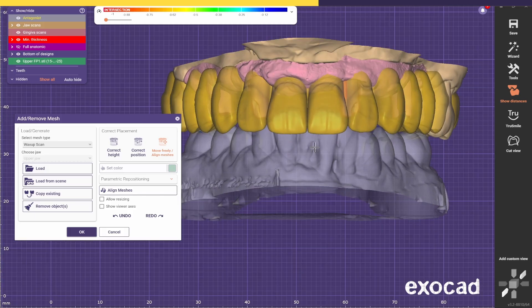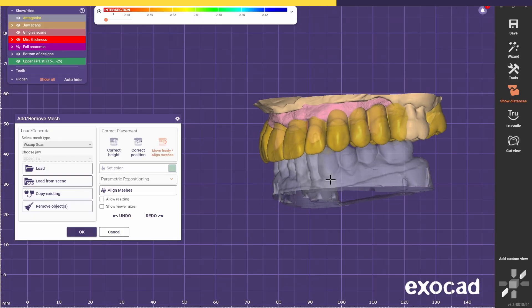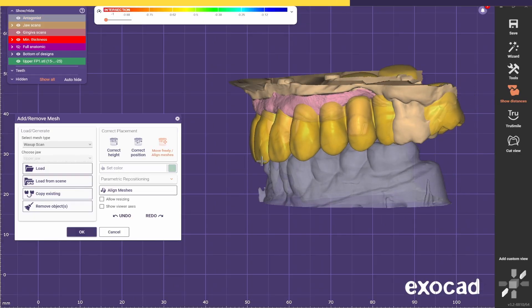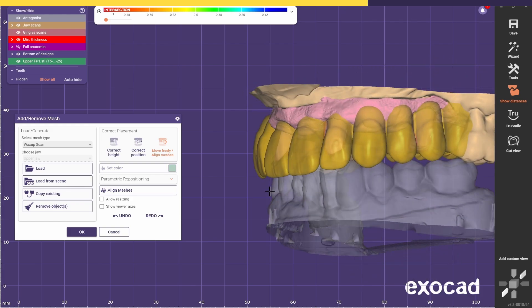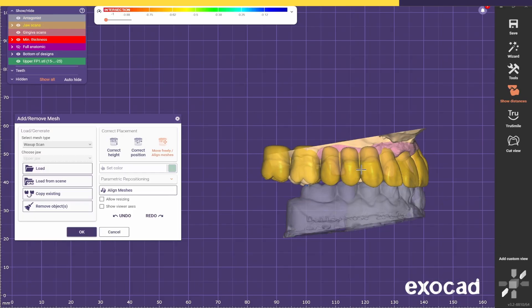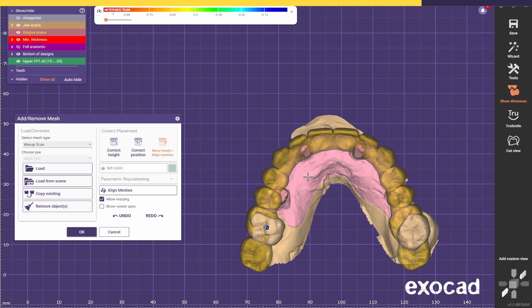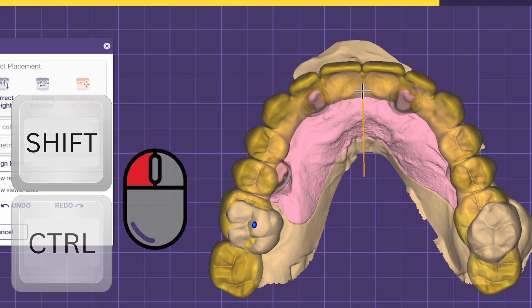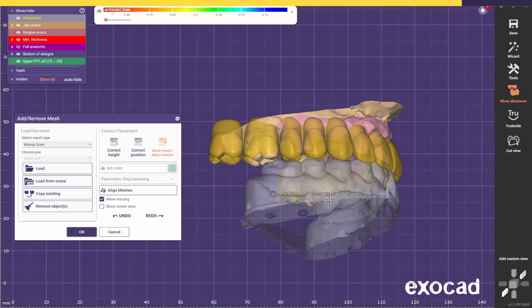Because in this case we don't have any pictures and we don't have any pre-op, I'll just try to place it in the most optimal place using other features like the ridge. Because this is going to be a try-in, later on the dentist can check if the placement is correct. I usually like to start by placing the centrals in the most optimal position, trying to make sure I have the least overjet possible. I need to allow resizing so I can change the sizing of the Waxup and make it a bit longer to close the distal gap.